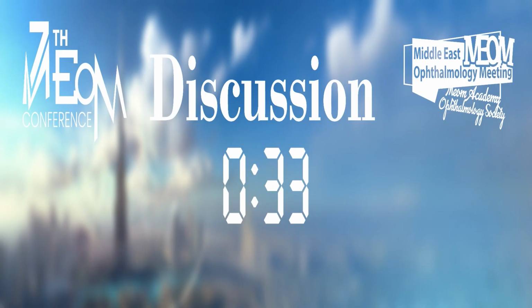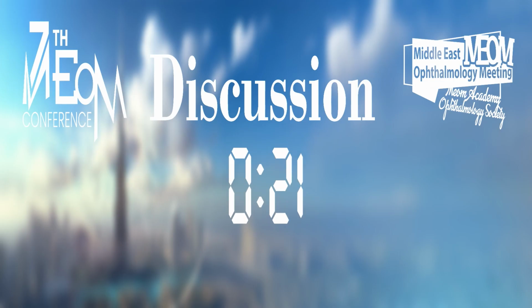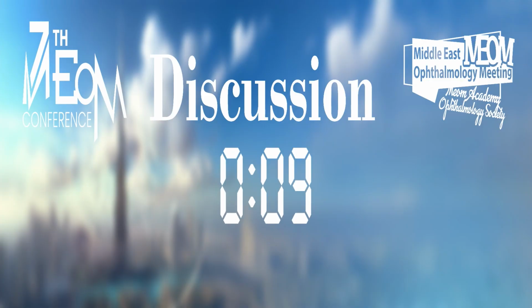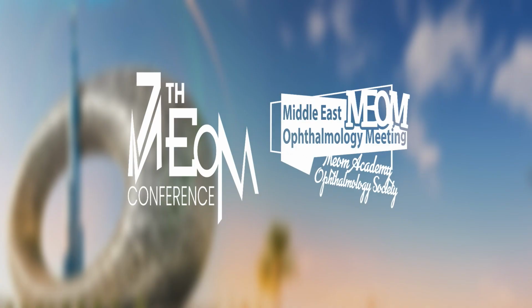So OCT angiography is especially useful for this part, but fluorescein, I repeat again, will remain and will never die as regards vasculitis. To see the dynamic flow of the dye in vessels, this is the indication for angiography. To put an end to this, because you are talking about OCT angiography plus OCT: once you do angiography, you don't do angiography alone. You have a structural OCT combined, so it can replace fluorescein angiography in the central area.